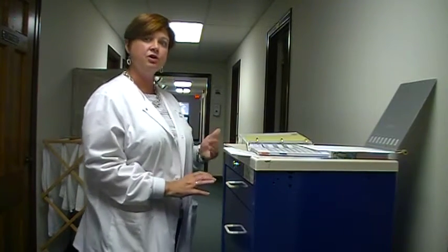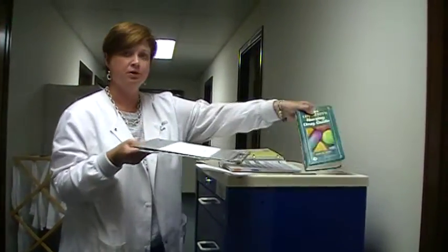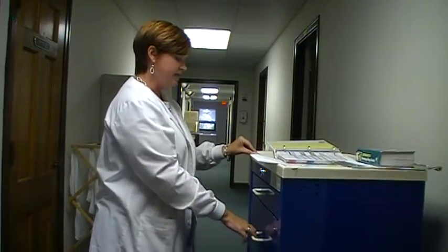For this instance we are going to be giving insulin. If you're not sure of what drug you're giving, you need to make sure you are looking it up in your drug book. Preferably in a clinical situation, do that before letting the instructor know. If I didn't know information about the insulin I was given, I would have to look that up.